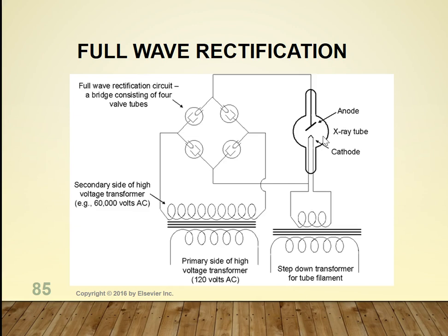Because now if you're getting the full wave, you've got more power coming in, so you don't have to use as much power to try and create the X-ray.